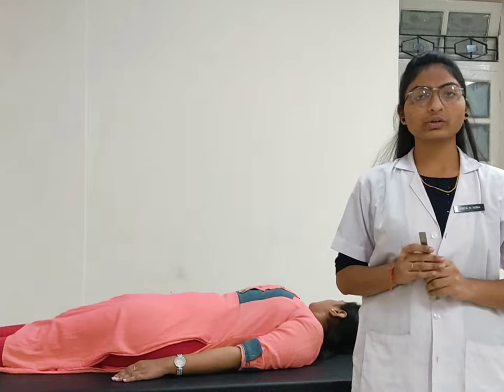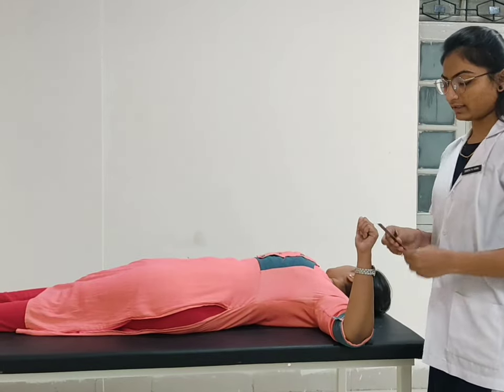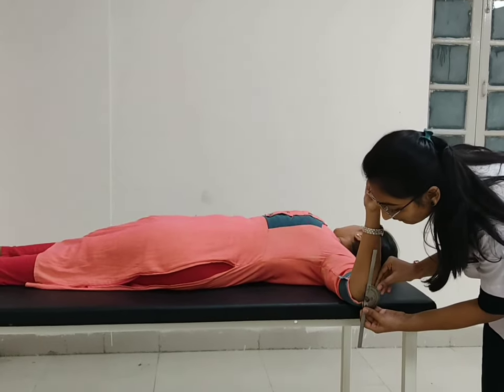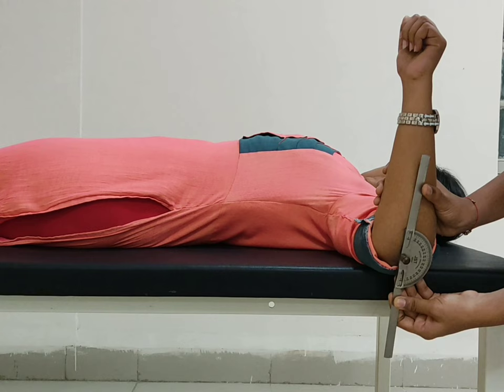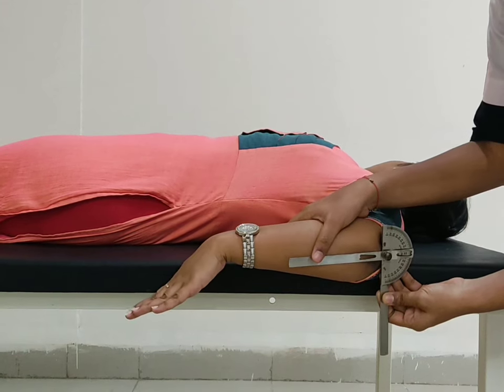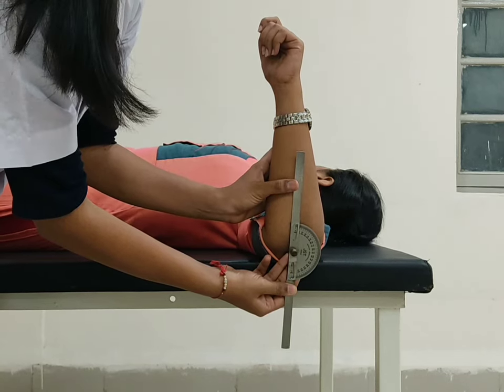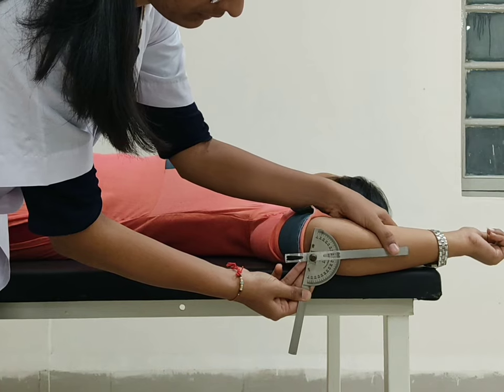For shoulder rotation, patient position with fulcrum placed over the acromion process. Moveable arm parallel to the mid-axis of the forearm and stable arm perpendicular to the ground. For internal rotation, ask the patient to move your arm down towards the feet. For external rotation, ask the patient to move your arm up towards the head. Normal range of motion for internal rotation is 80 degrees and external rotation is 90 degrees.